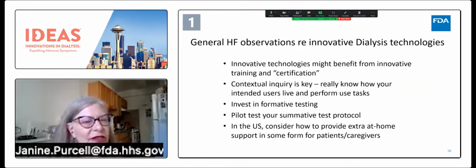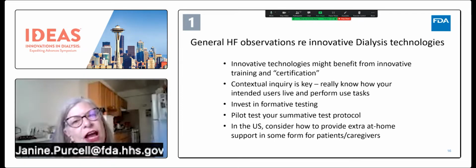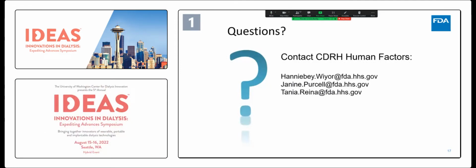And I just wanted to say a few things real quickly about things to think about in terms of human factors engineering and innovative things. When you're talking about innovative technologies, think about innovative training and certification. A lot of repetition maybe, or really taking advantage of graphical ways of presenting information to help people understand conceptually what's going on, and understand also just functionally and operationally how to make connections and such, really optimize that.